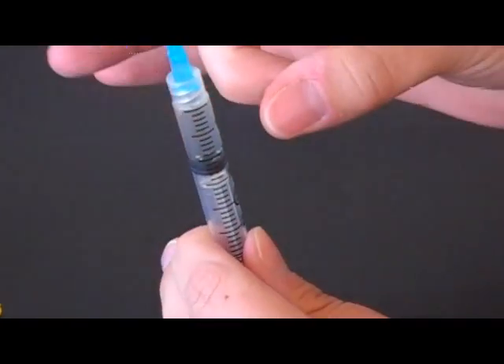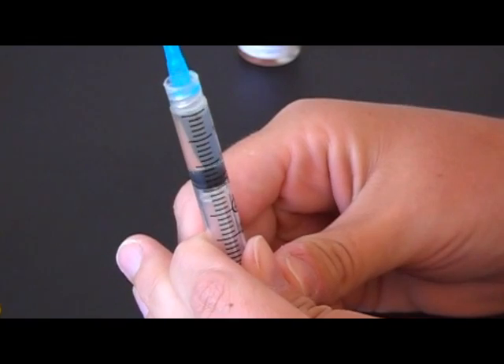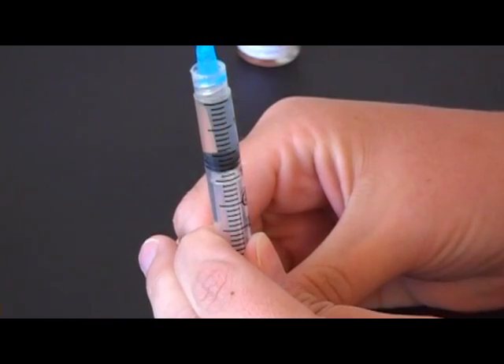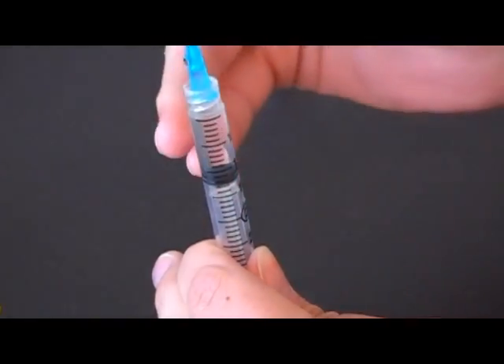To remove air from the syringe, flick it until the bubbles come to the top. Then pull back a little bit — you'll see the fluid line. Push up on the plunger until you have a drop of fluid at the tip of your needle. Go ahead and put the cap back on. We're going to get the patient ready.